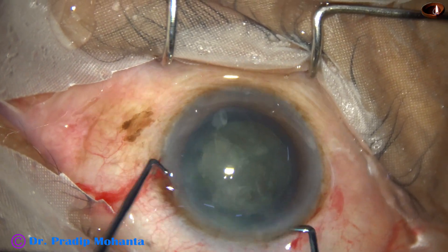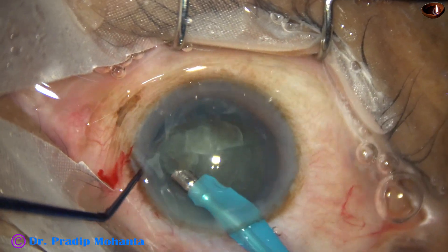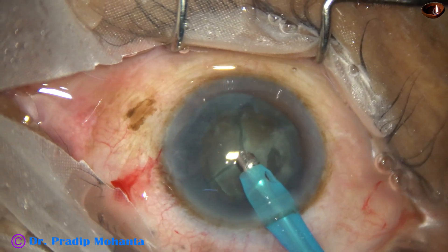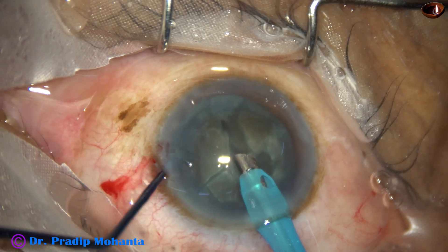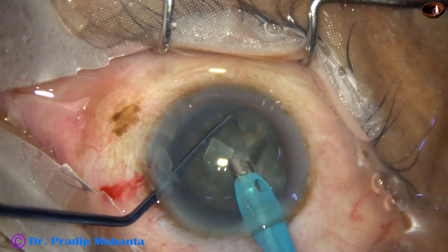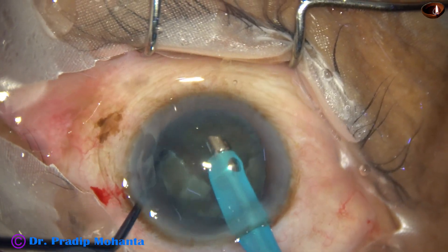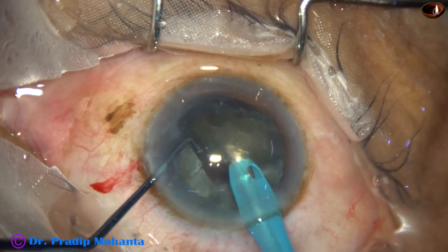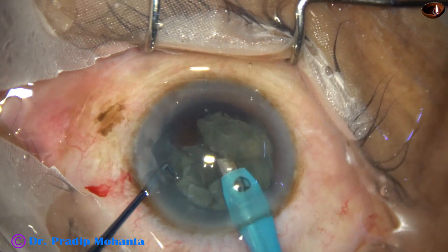So we have got four pieces. Now the pieces are picked up, some superficial cortical lens matter is removed. The pieces are free from each other and they are easily taken out of the capsular bag and emulsified.